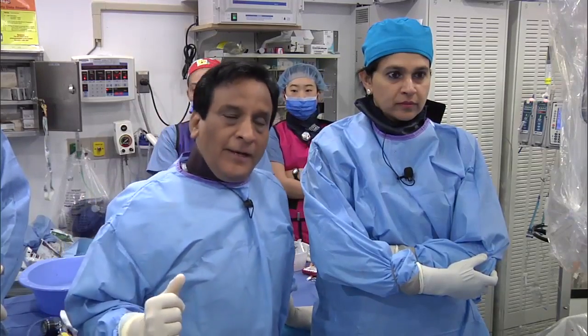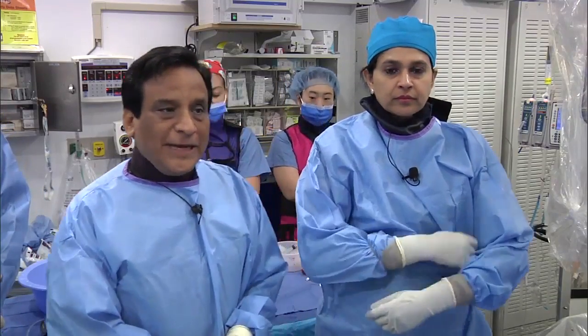The first day, the case was an 87-year-old patient with severe aortic stenosis and extensive CAD: calcific left main, LAD, circumflex, RCA. Declined surgery, rightly so at 87, with COPD also. In that case, we did a balloon aortic valvuloplasty, followed by orbital atherectomy of the left main and LAD, PCI of the diagonal, and put two stents with the stent crossover technique.